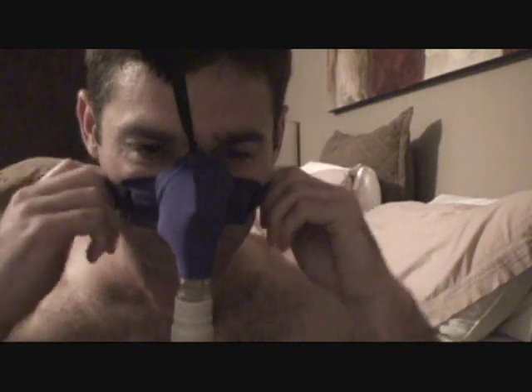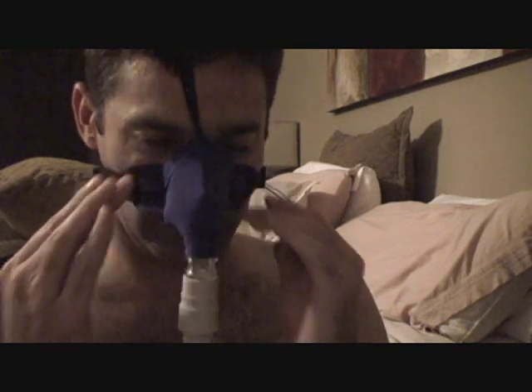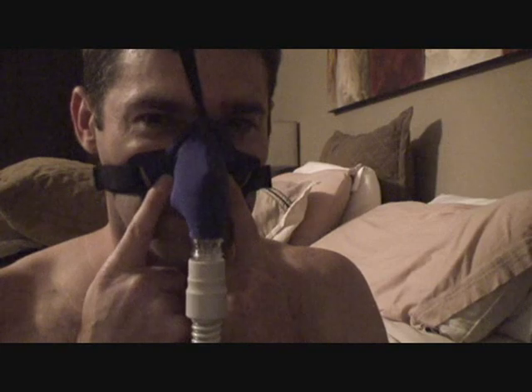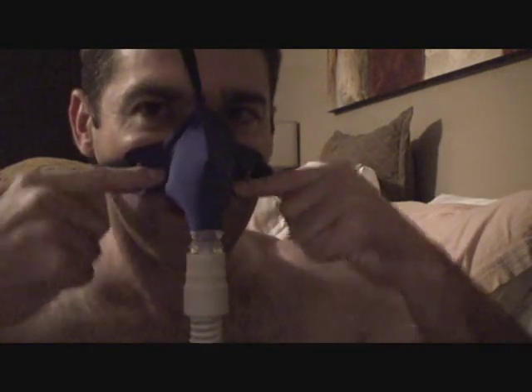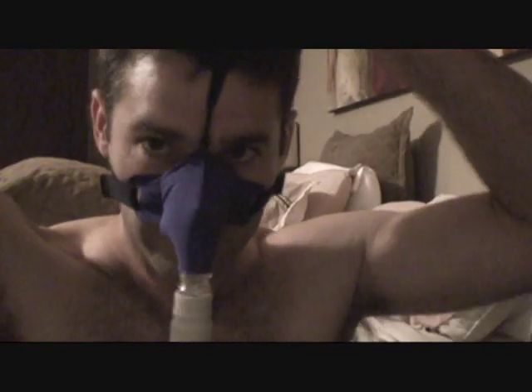While I'm screwing on with this, now's a good time to tell you that 12 centimeters of water pressure is just kind of a random number I pulled out. I would call it high average. I think most users are below that, but it gives you a good feel for what the leak's going to be like if you have any problems. Right now I'm kind of figuring that if you push in where the leaks are, it allows the balloon of the mask to fill up. The whole mask is like a balloon.